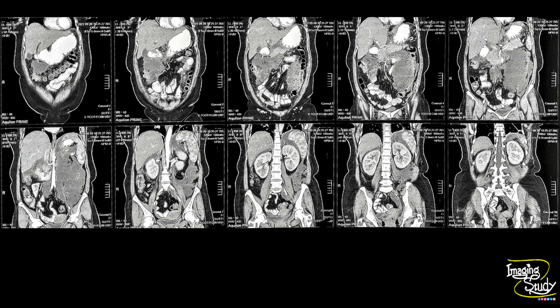Here are the reconstructed coronal sections and you can see this collection at different areas. All of these are inflammatory collections as a complication of acute pancreatitis.